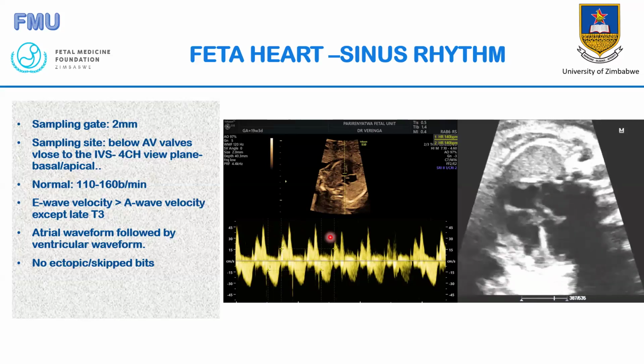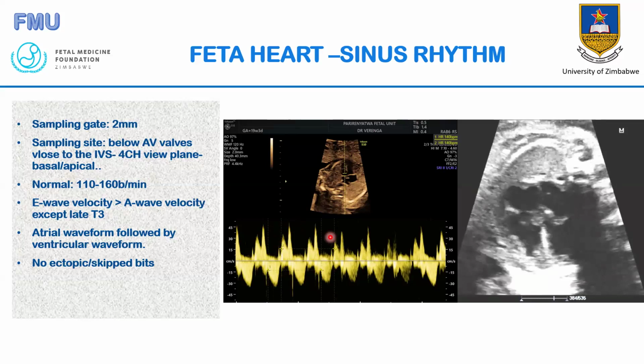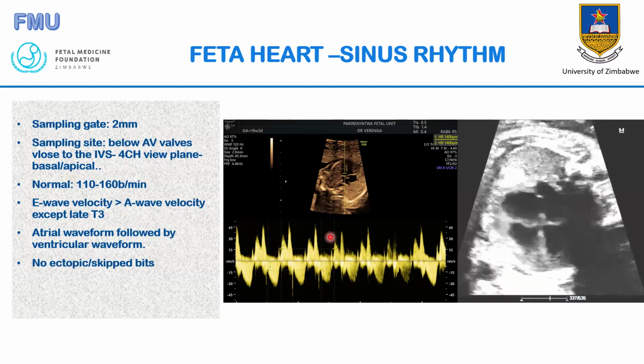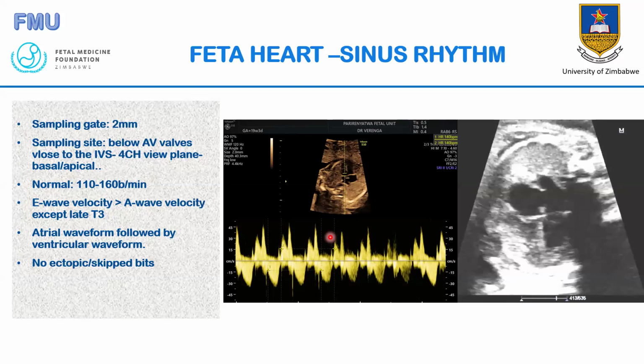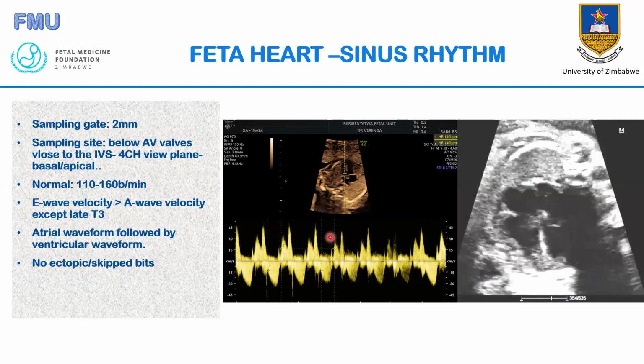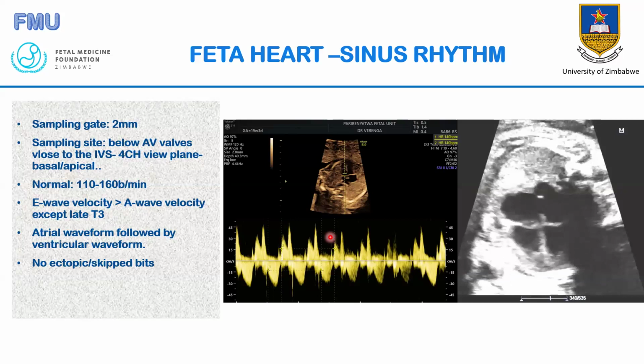The other one is called the active contraction. So the passive contraction just happens without the heart being pushed too much. This is normally followed by the active one. The active contraction, the atria really contracts. This is why we have a biphasic waveform here.